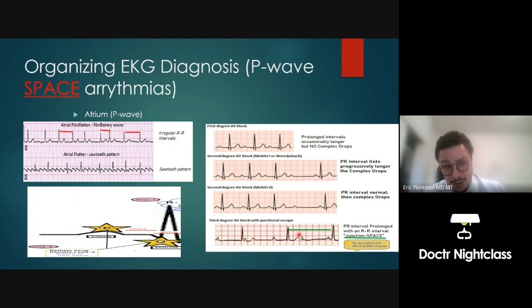Now remember, we have characteristic arrhythmias. We have fibrillation, which has a difference in RR intervals and the little squiggly P waves. We have a sawtooth that looks like someone bit a bagel, but the RR intervals are the same. And then we have this characteristic one, the third degree AV block. We have this junction space. Huge, huge, huge. They're probably not likely to go after that. This would be like a diagnosis of exclusion. Like there's nothing else, it's this.